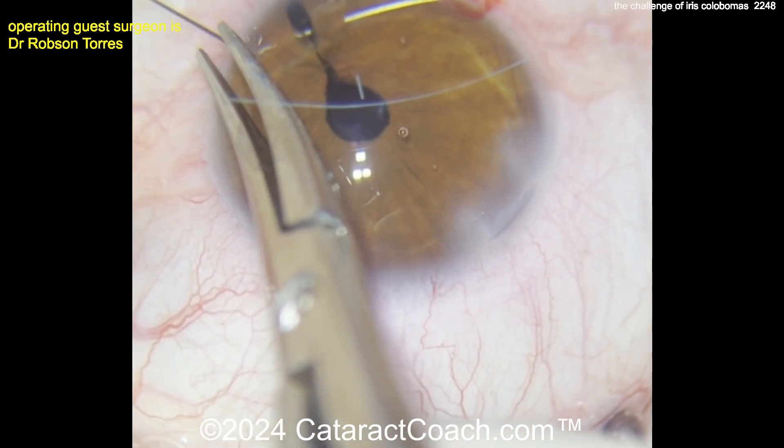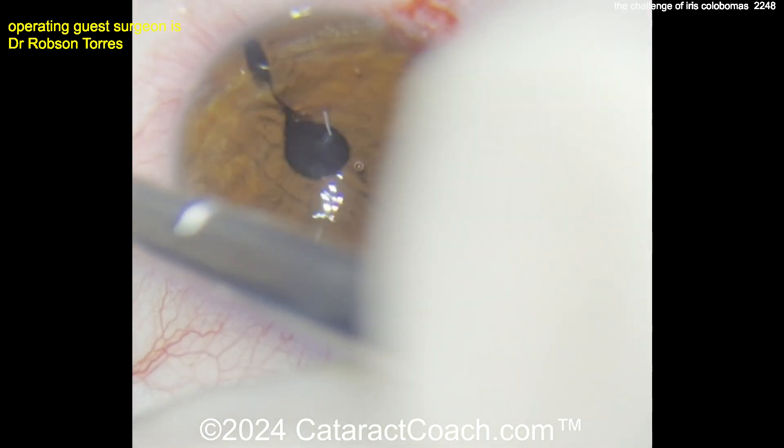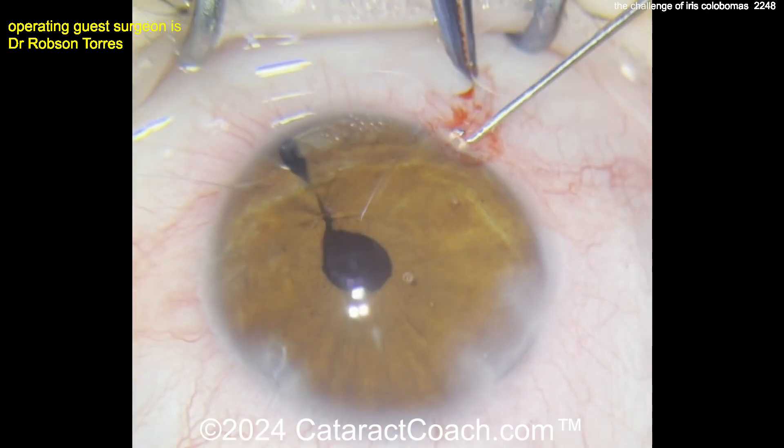This procedure of suturing everything up does take a lot longer than you might anticipate. Don't do a quick, hurried surgery thinking you'll get this done in about 10 minutes — there's just no chance.